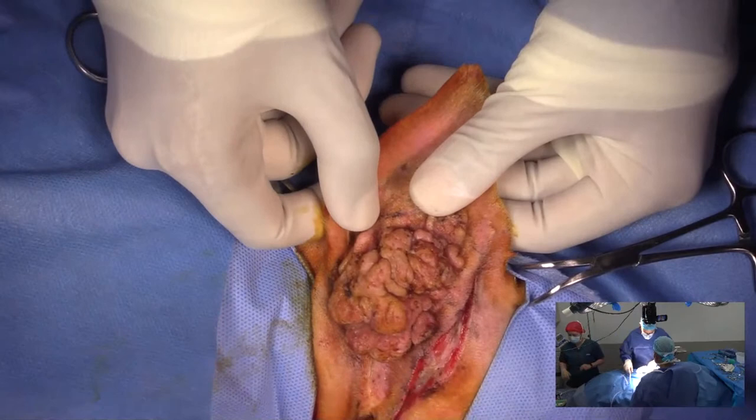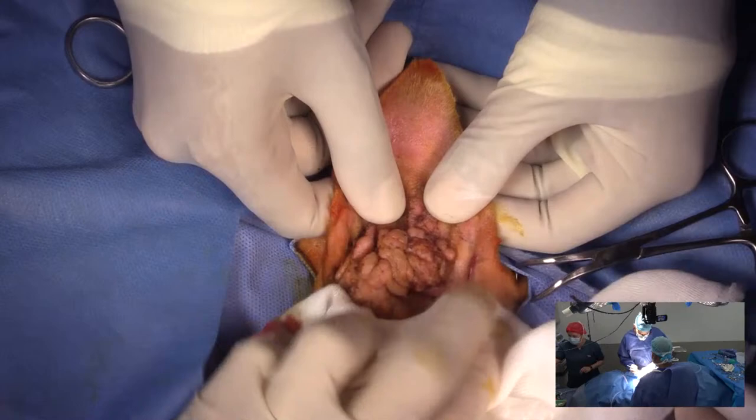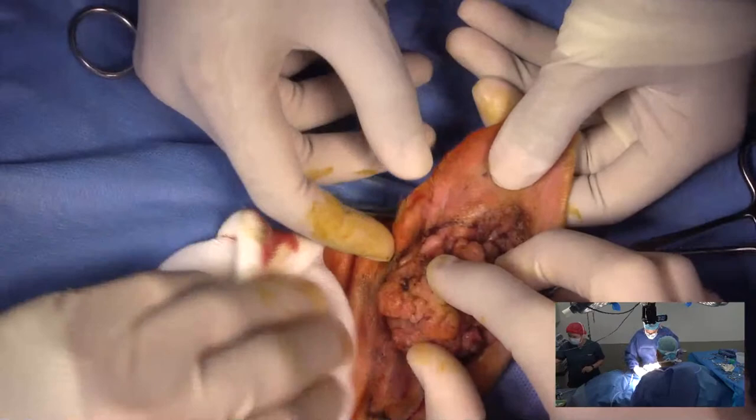Now, as I've said before, staying right on the cartilage, the auricular cartilage of the ear canal, is the best way to avoid the facial nerve. So just have your tract back here.